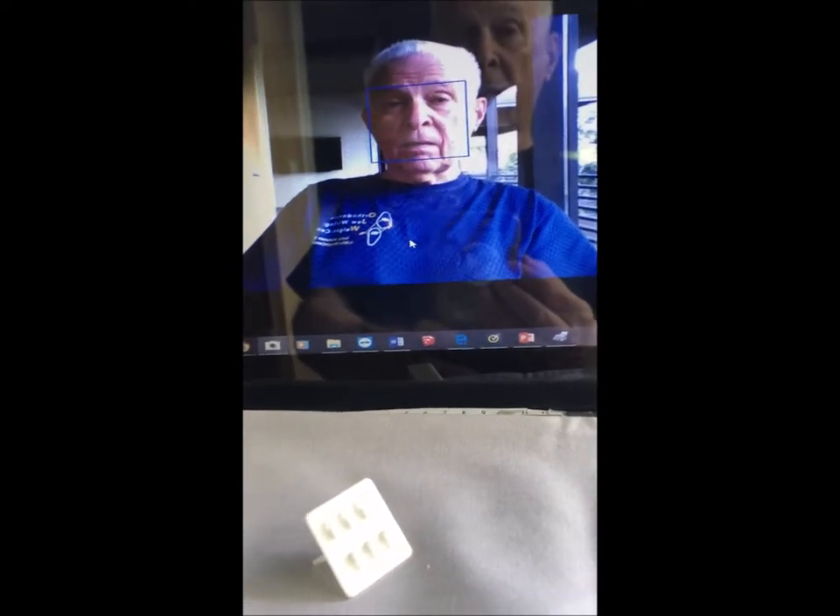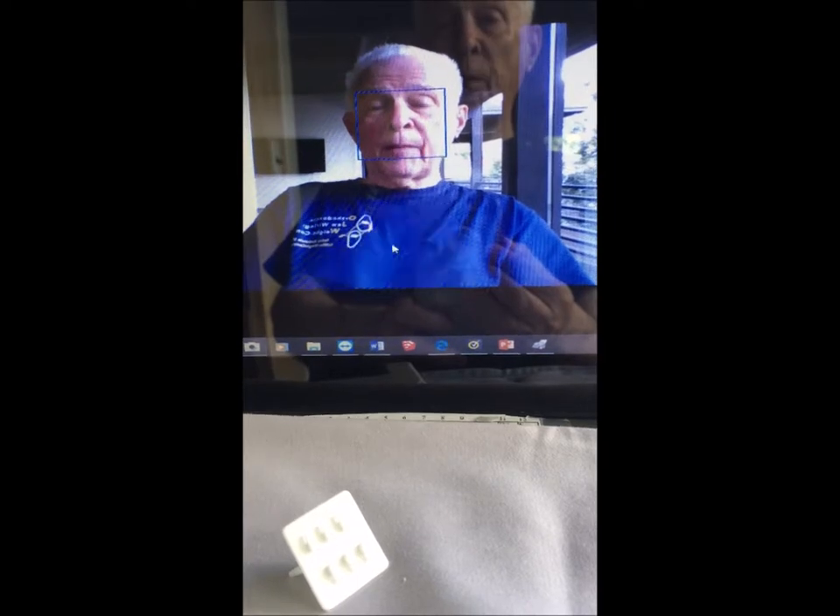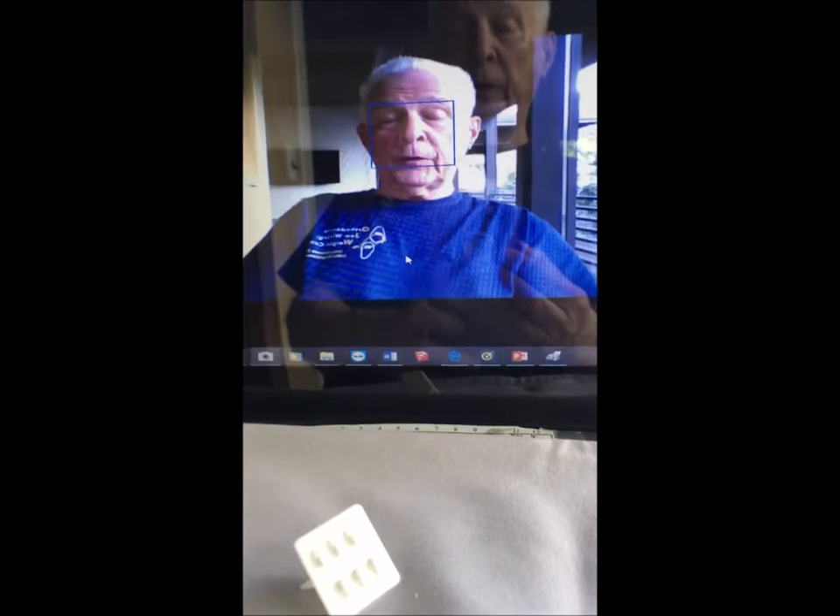Good morning. I'm Dr. Teddy Rothstein, the developer of orthodontic jaw wiring for weight control. This morning, I'm going to show you the first 3D printed OJW demo tool, which is going to be used to help patients learn how to wire and rewire their jaws. Here is the tool.